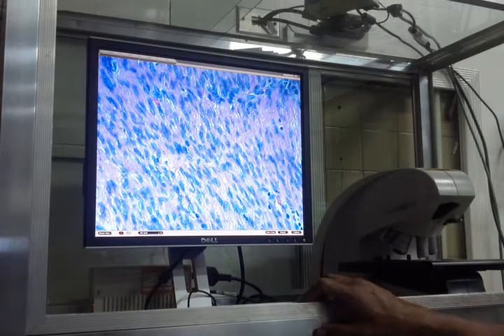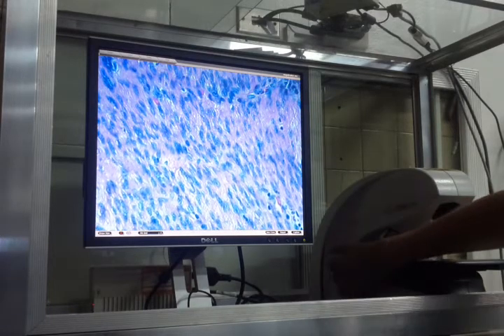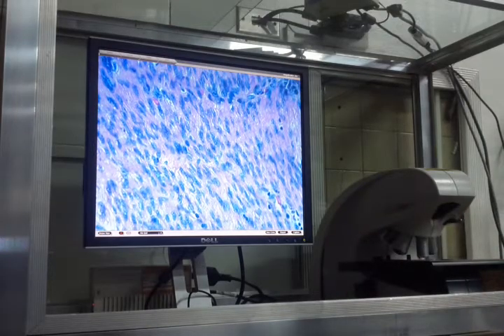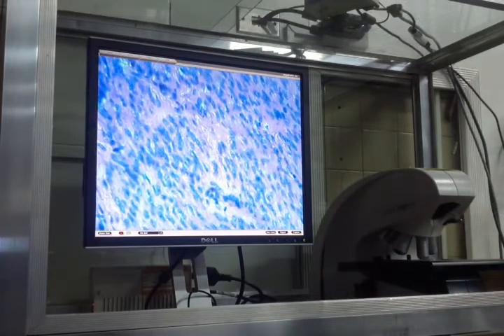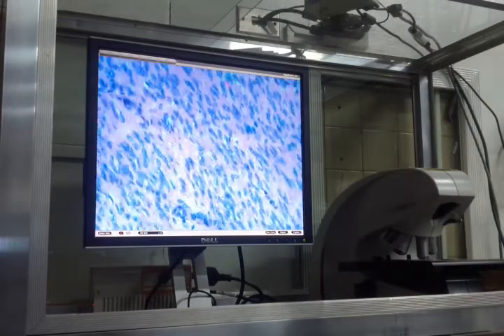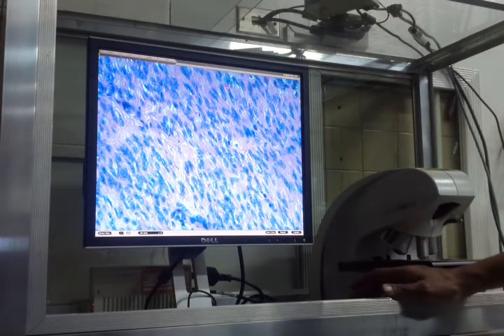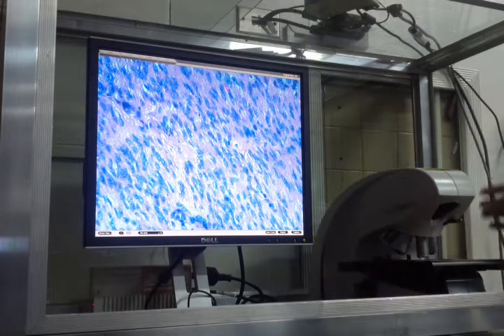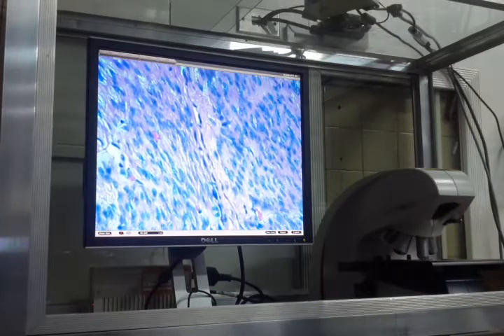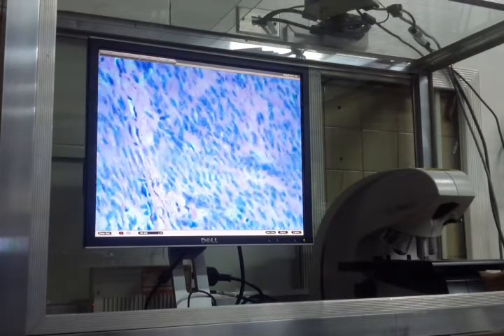Diameter. Oh, may maitim ba dyan? Ito, may telophase pa yun. Kaya nga, may telophase. Hindi. Yung nakapokus mo kanina. Yan lang to. Oh, pare-pareho naman ah. Uniform, di ba? Uniform cell, centrally located, elongated nuclei. No pleomorphism, no hyperchromaticity. Although there are some mitotic figures, they are rare.